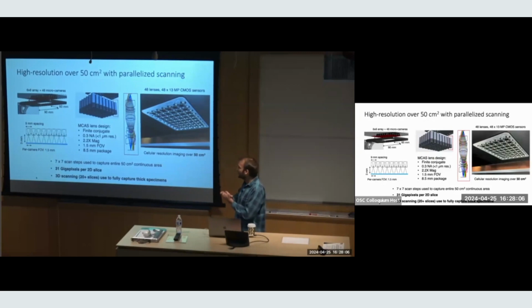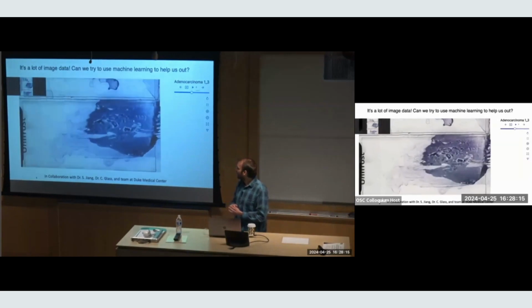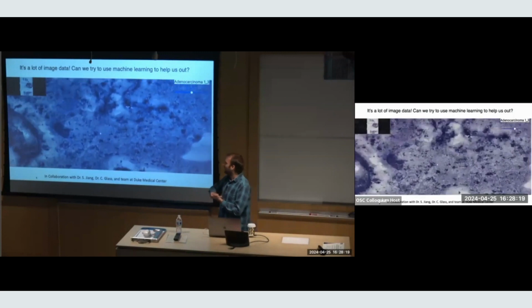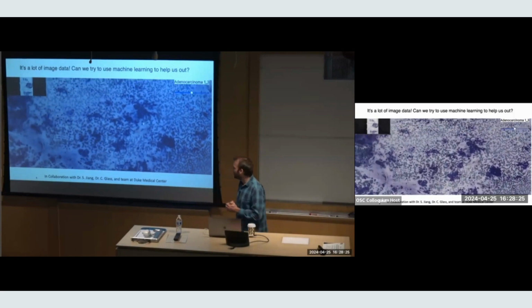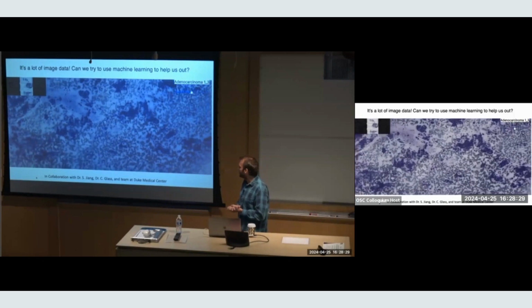Okay, so we use this to scan slides. This is still ongoing work. We put 3 slides down, and then this is just a video of the data we capture. And you scan them out. We're also scanning in 3D because these are thick cytology specimens, so they have a really curvy surface. And then we just do a projection. But this is just an example of the type of data that we're capturing.